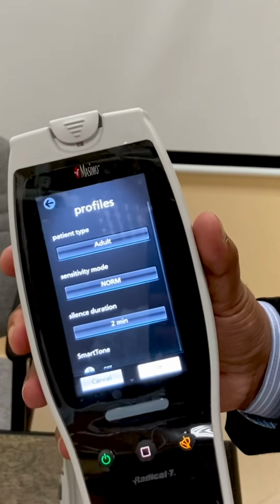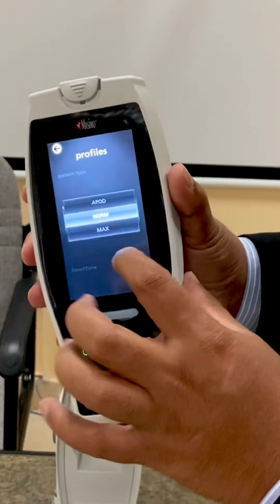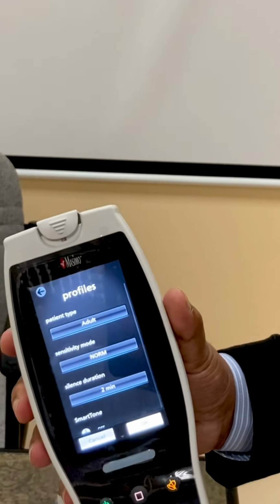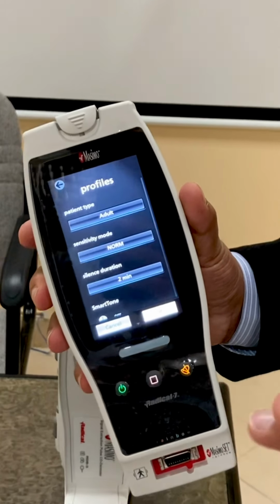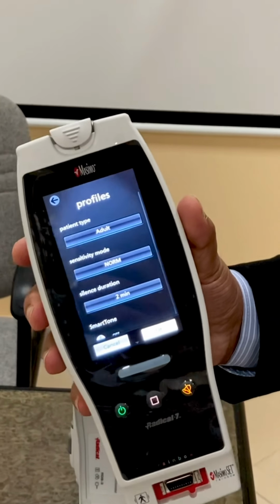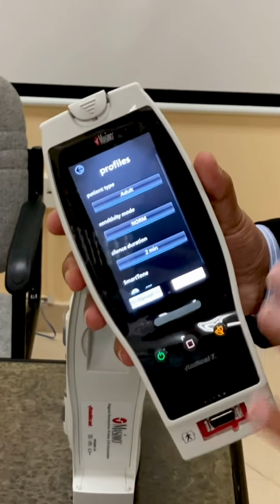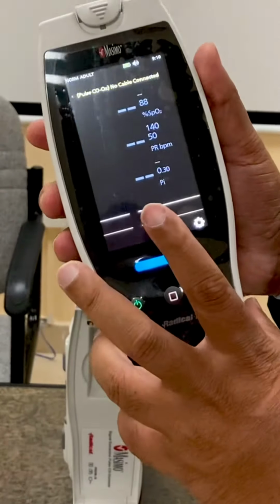There are 3 sensitivity modes. Only Masimo has that sensitivity mode. The first one is normal, and you can see max and another one. What is max? Max is for when you have very low perfusion and you are not obtaining any SpO2 values. Then if you use max, it will wait for a second, and then it will collect the maximum value in that period. So in the case of neonatal patients, if they are not getting any values, you can use it. In all other cases, use the normal mode. Normal mode should be the one. Then press OK.